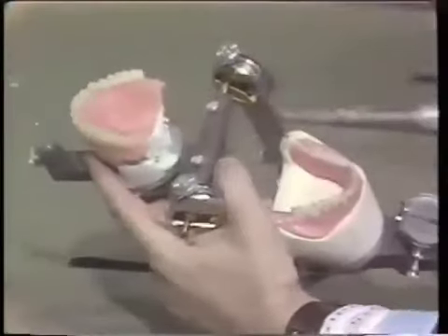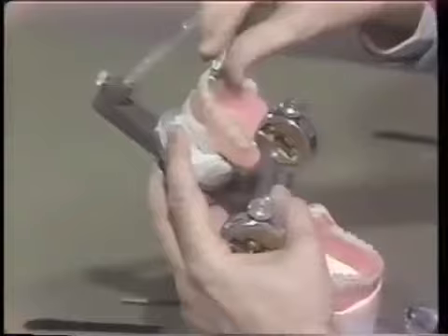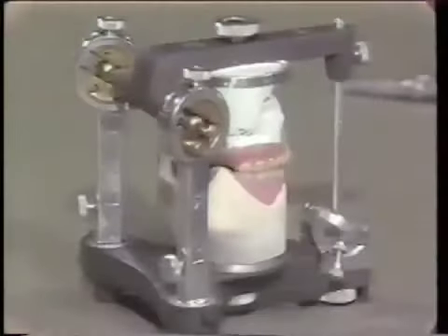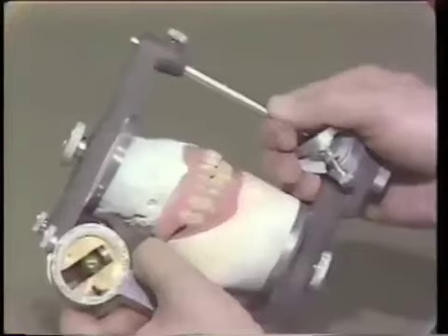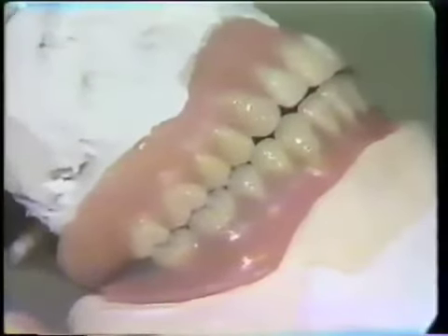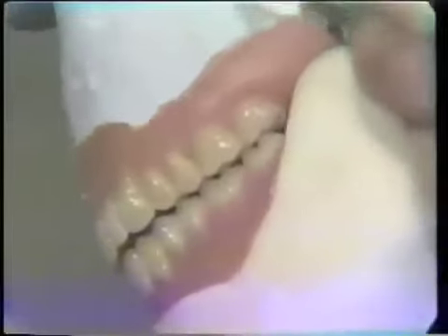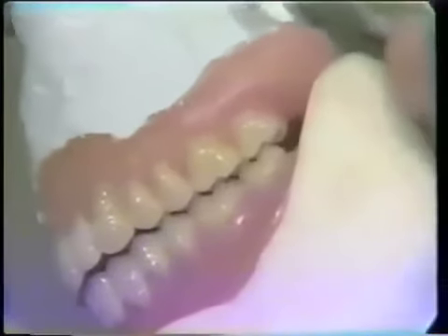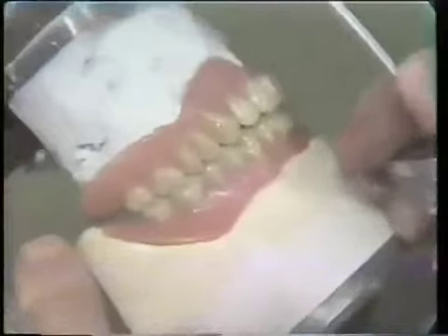Instead of demonstrating every step of grinding on this case, I will go off camera and complete this side. By adjusting only the buccal of the upper teeth or the lingual of the lower teeth for interferences on the working side, I have adjusted so that it glides through very satisfactorily. We have also begun to pick up our contacts on the balancing side — this is the most difficult thing to do. Now we have to look at our last excursion, and that is protrusive.